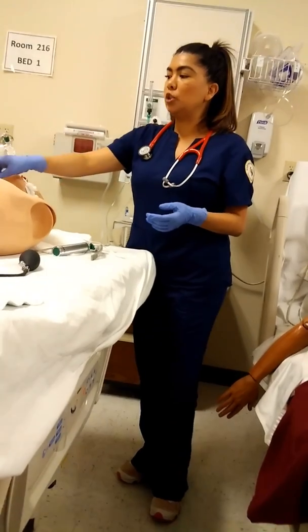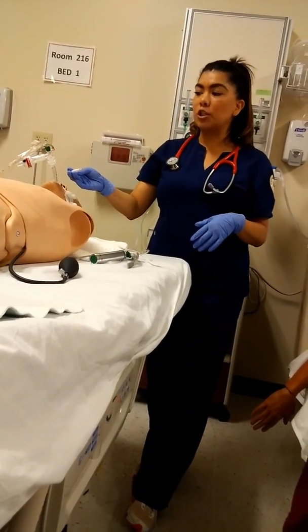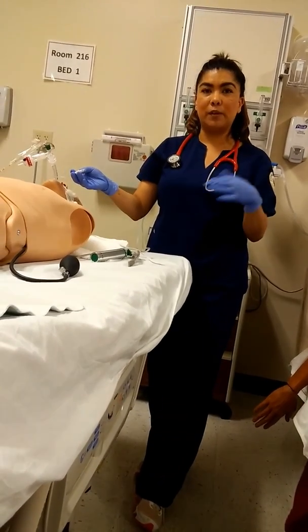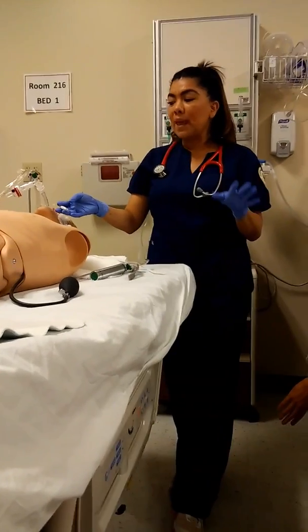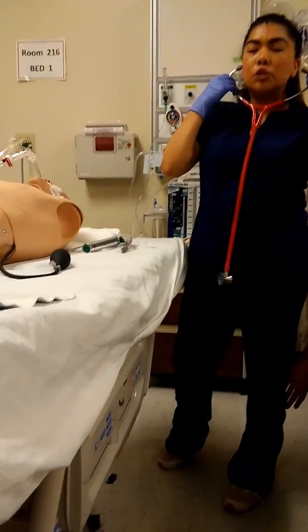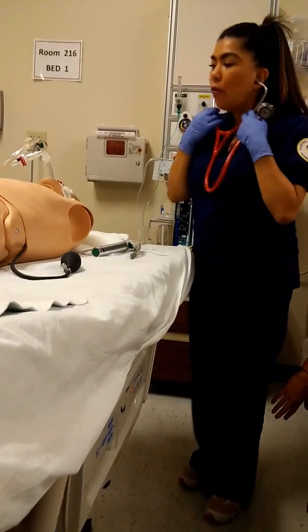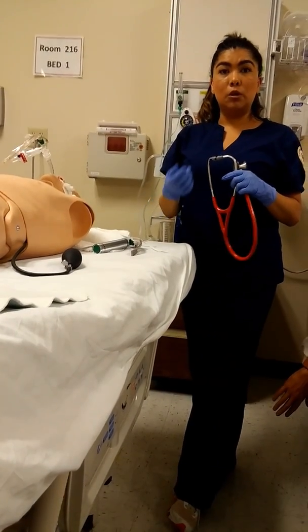We also want to check the cuff pressure. So we would use a manometer to check the cuff pressure. So the pressure that we're checking for would be from 20 to 30. If we do not have a manometer, then we would go ahead and use our stethoscope to go ahead and listen for a minimal leak and a minimal occlusion.